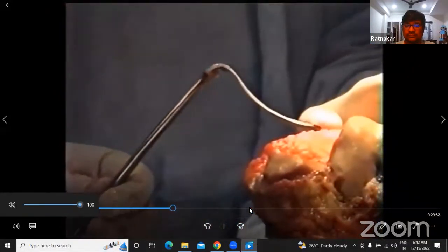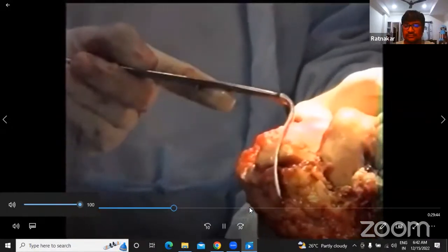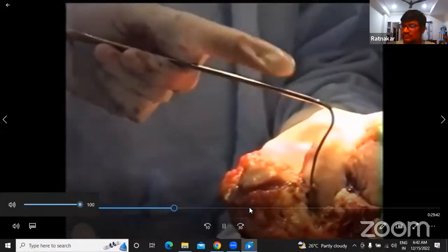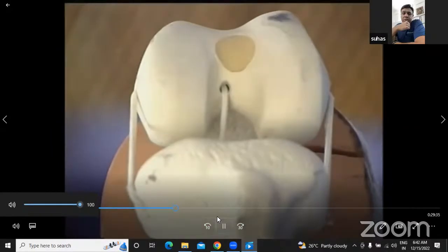A very important instrument in knee replacement is called a patellar retractor, with a curve here. It's a simple instrument, but it nicely sits to the lateral part of the tibia. That is the patella. Now I will again expose the lateral side.